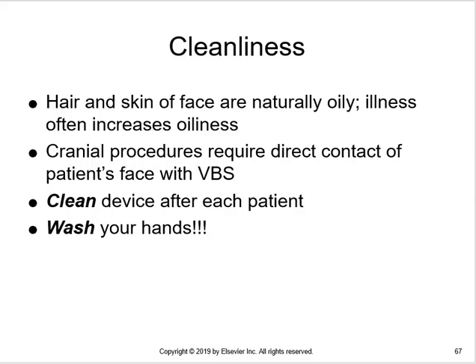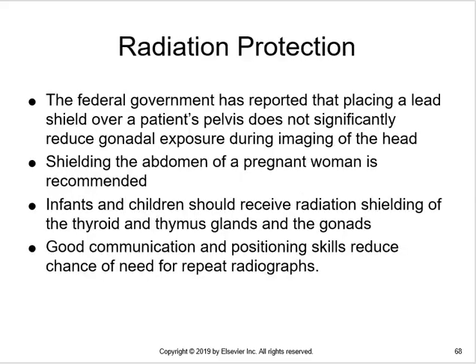If you're going to ask me to put my face on a wall bucky, I'm going to want to know that it's clean, and I'm not going to want to assume that you did your job after the last patient. I want to see it happen. So clean it in front of the patient so that they know that they're putting their most intimate anatomy onto a clean surface. So wash your hands, make sure that you've got your gloves on, if that's hospital protocol, and make sure that the equipment is clean as well.